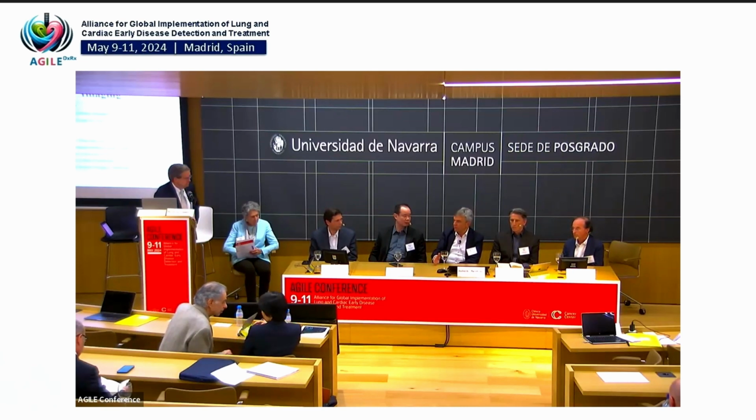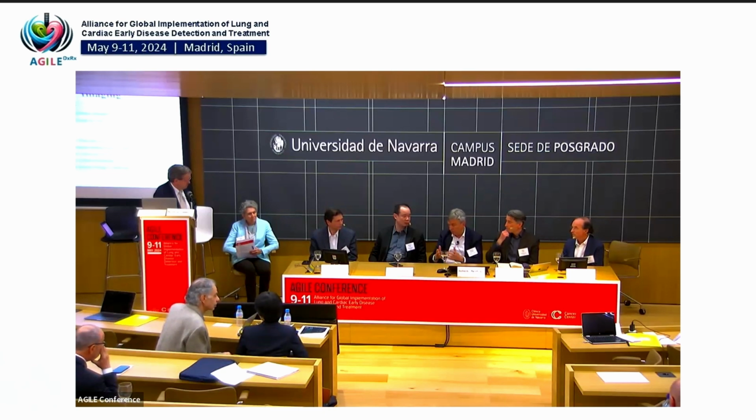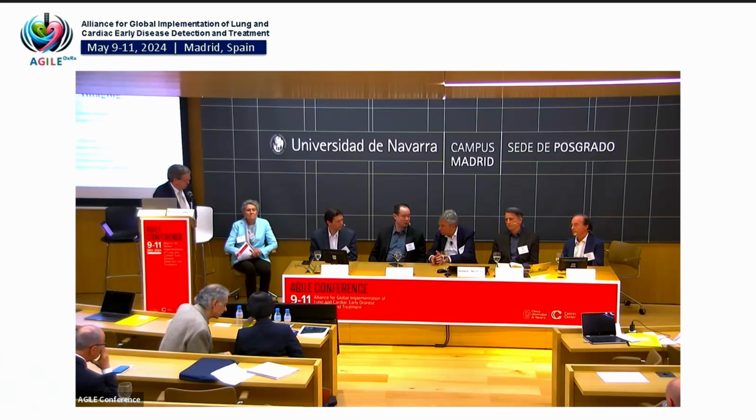For example, you cannot use any iterative reconstruction for calcium scoring. The calcium score will dramatically go down with iterative reconstruction. You cannot apply any value that has not been established in all the evidence that there is. So you also have to comply with what we did in all the studies, the results that we have of EBT as the best methodology in terms of temporal resolution combined with spatial. We translated that to the applications with dual source systems, first, second, and third generation.